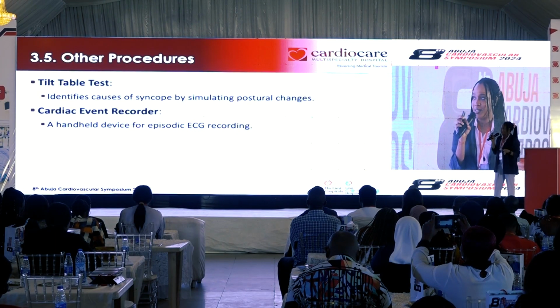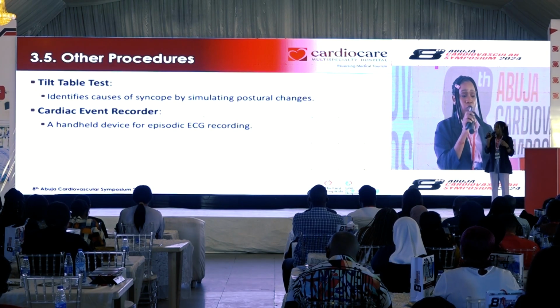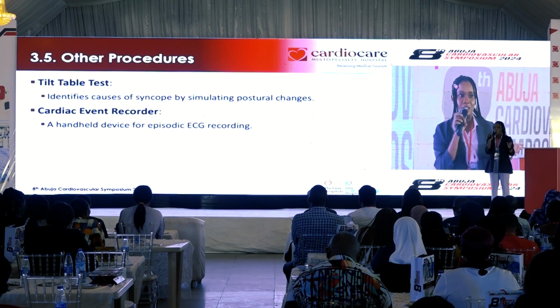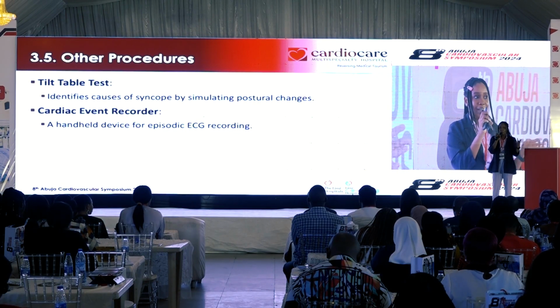Okay, so this is used to identify syncope and the type of syncope, whether it's coming from the brain or from the heart. And we have the cardiac event monitor. These are portable devices, pretty much like the Holter ECG, but the difference is they carry it home for like 2 to 3 weeks.